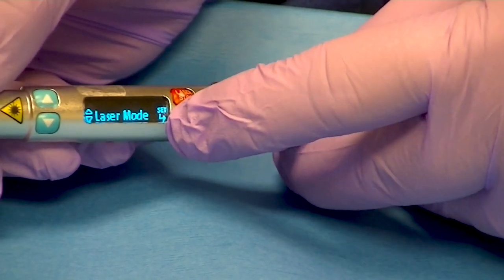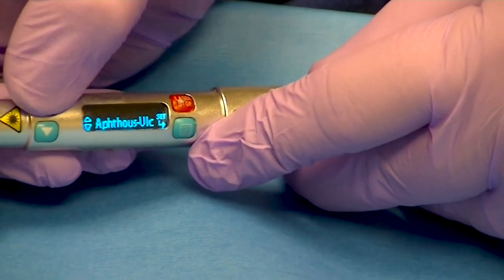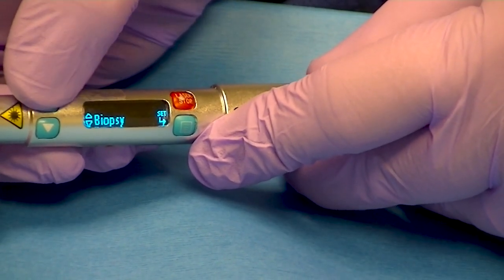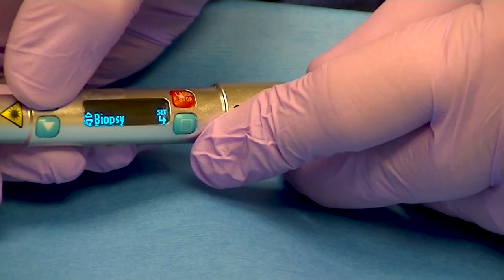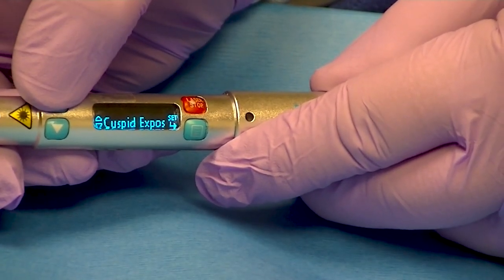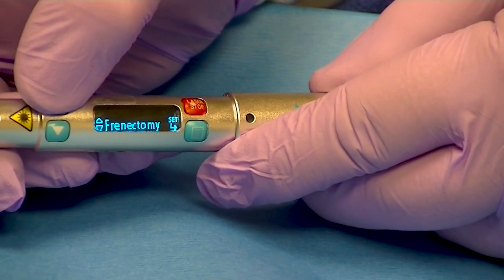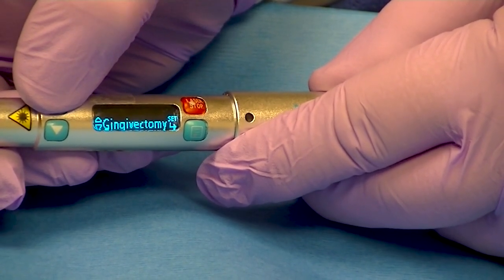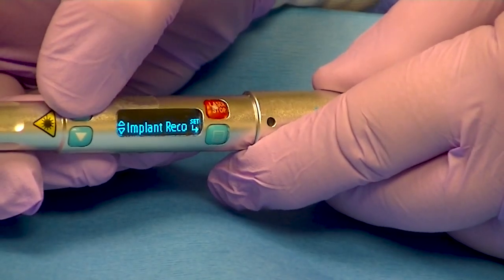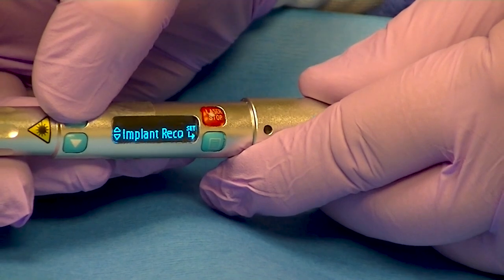Going back to menu: laser mode, procedures. So it's aphthous ulcer, biopsy, class 5 restoration, cuspid exposure for orthodontic use, frenectomies, gingivectomies, hyperplasia, implant uncovering — which I like to use a lot. It's very non-invasive.